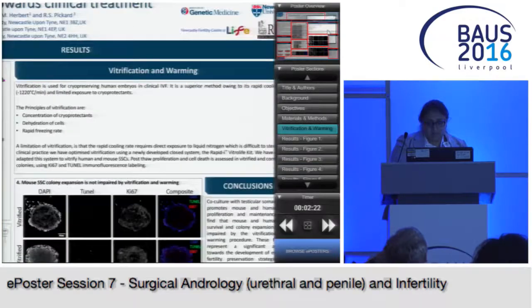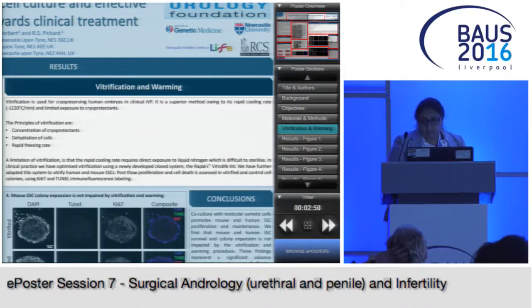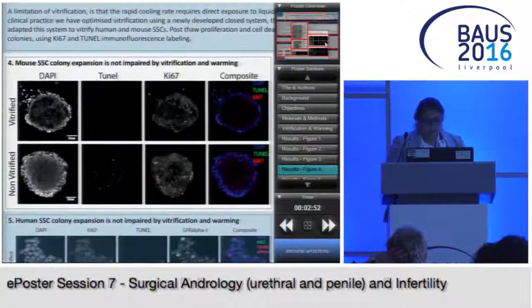I then wanted to work out how I can freeze these cells, because previous studies have shown really poor cryopreservation survival rates. So I used vitrification because that's something they were using at the center I was working at in cryopreserving human embryos for clinical IVF. Vitrification is just really rapid cooling, which skips the ice crystal formation step, so the cell membrane tends to stay intact a bit better. I did that with mouse and human SSC colonies. They're about the same size as an embryo, actually, about 200 microns.